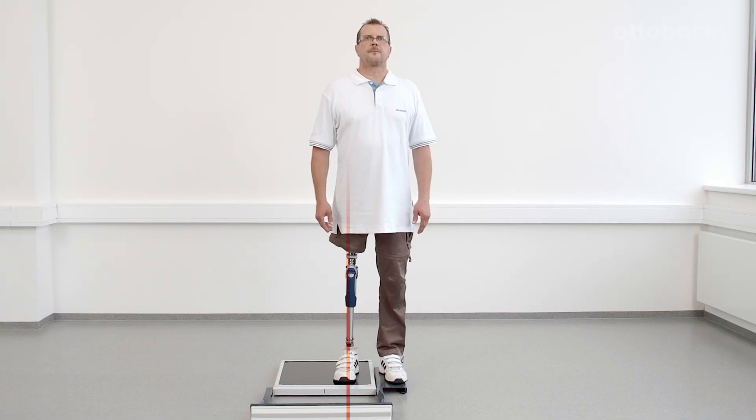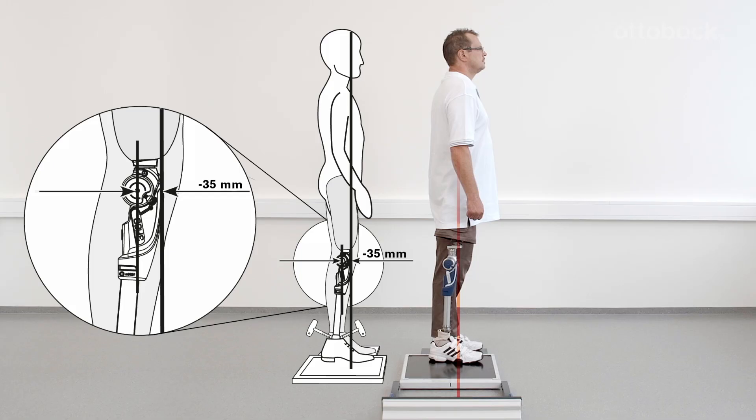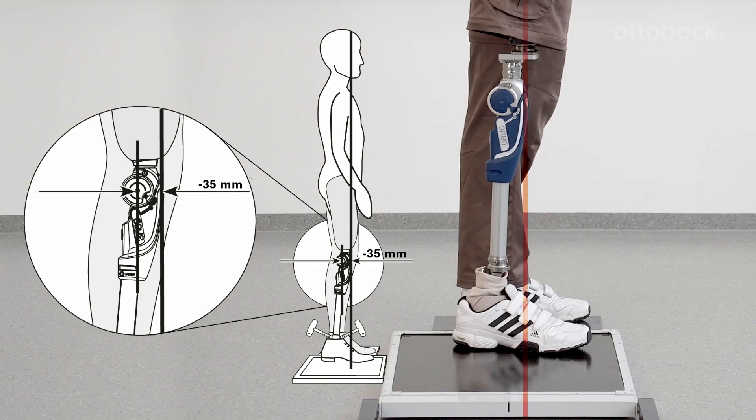Looking at the frontal view of the knee, the alignment reference line runs through the middle of the prosthetic foot, middle to outer edge of the knee, and middle of the socket. The alignment should now be adjusted solely by changes to plantar flexion, so that the alignment reference line runs about 35 mm anterior to the knee axis.